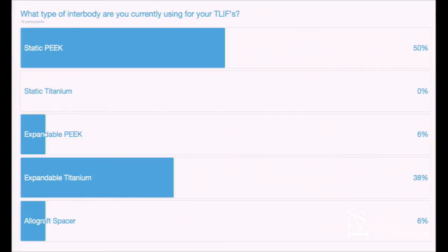especially in, say, laterals, where you're spanning the ring apophysis, and if you have a stable pseudarthrosis, you probably never, ever, ever know unless you get a CAT scan. So to me, I don't think PEEK is all that bad, and people have been trashing it over the last 5-6 years. Yes, you have to use BMP, and if you're not an advocate of BMP, use autograft then. And the fusion rates are 80%+.